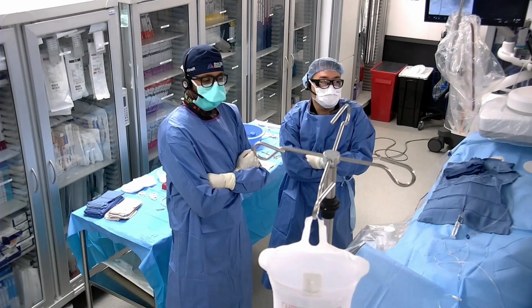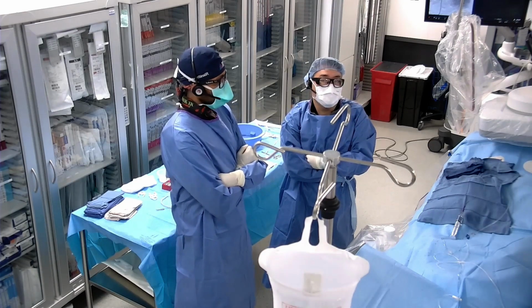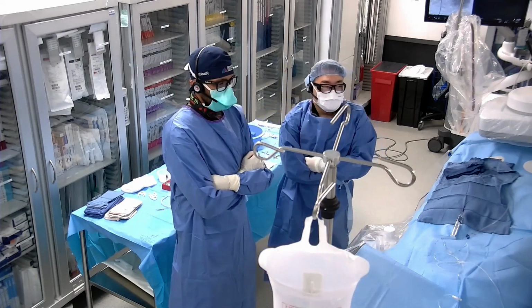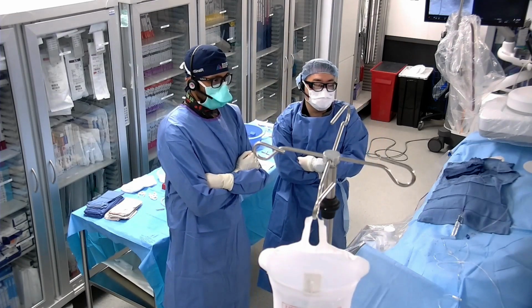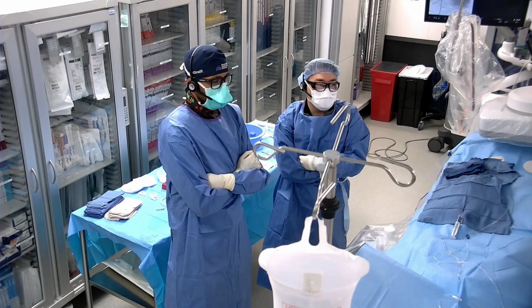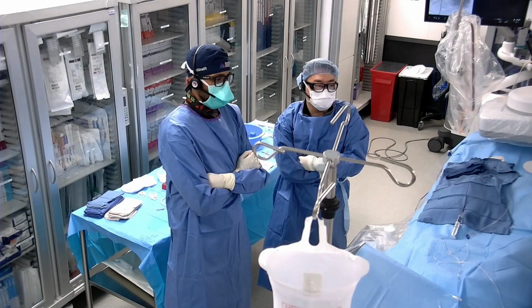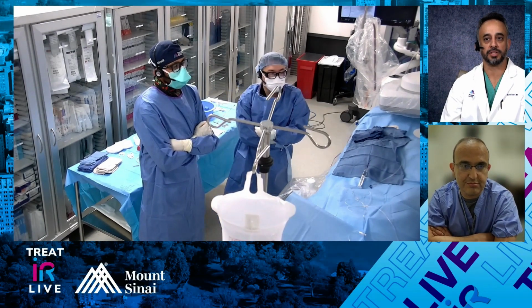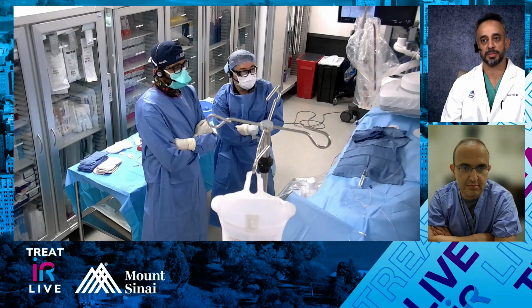Her proximal splenic artery is about 7.5 millimeters in size. And so, this is well over 2.5 times the size of the vessel just proximal to it. And the other thing is, as you mentioned, it comes to us from our hepatologist. We obviously have a good relationship with them.